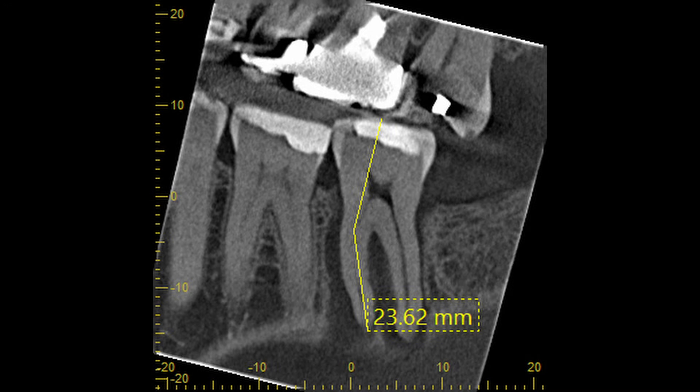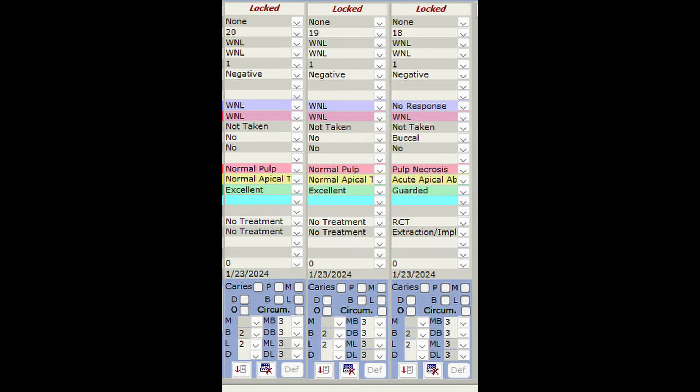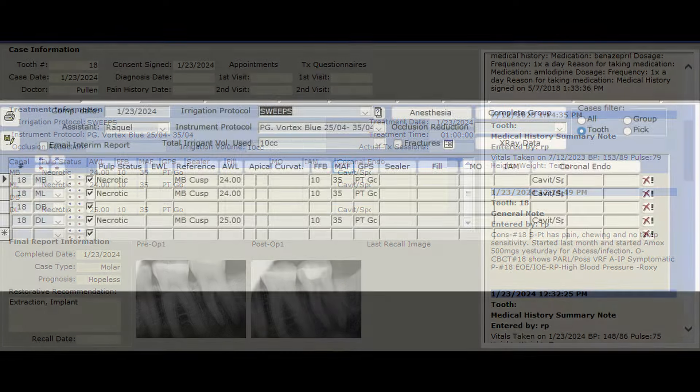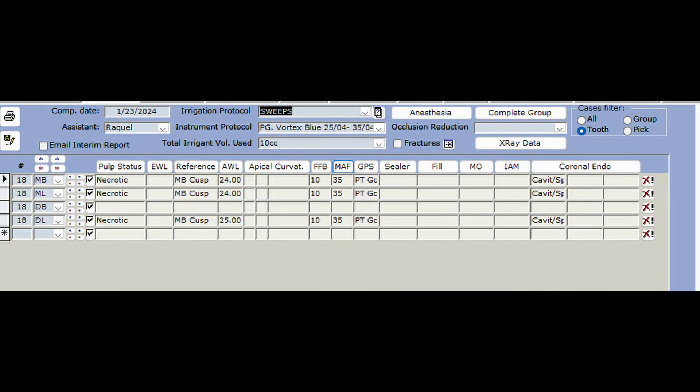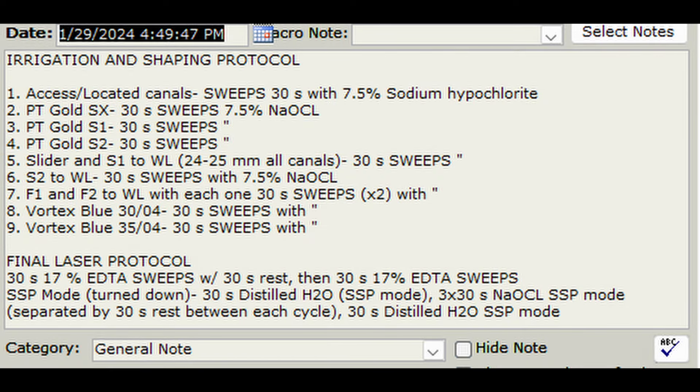He wanted me to try to save it even though he had a buccal abscess going on, buccal swelling. I went ahead and shaped it up to ProTaper Gold F2 and then decided to go bigger on the apical third and shaped up a vortex blue to a 35, all the canals. I then used the Photonis sweeps laser and I ended up doing nine cycles of sweeps with 7.5% sodium hypochlorite. That's a lot of cycles, but I figured I'd try it to see how well I'd clean it out.